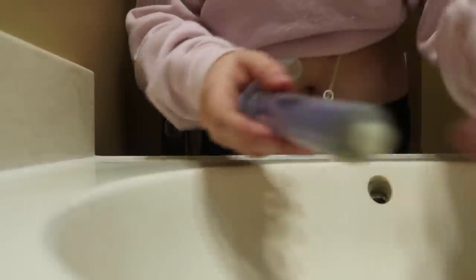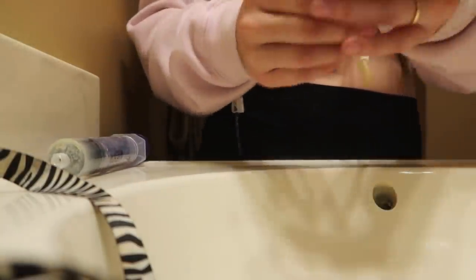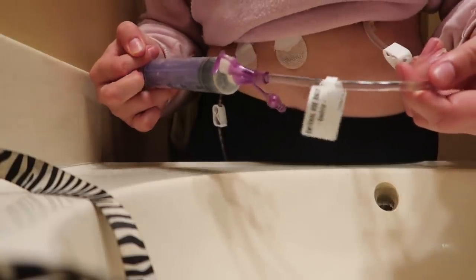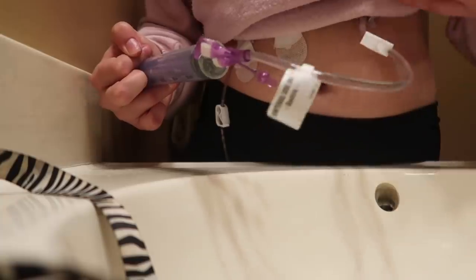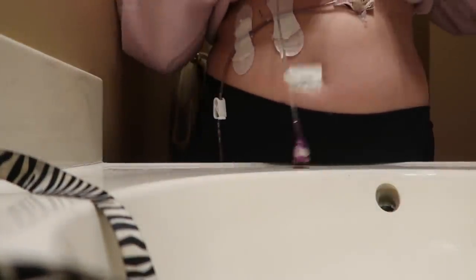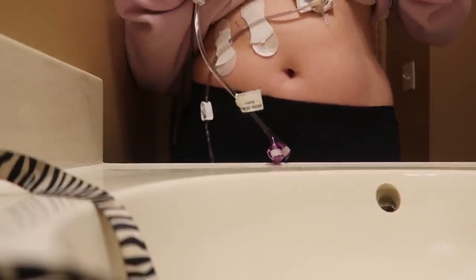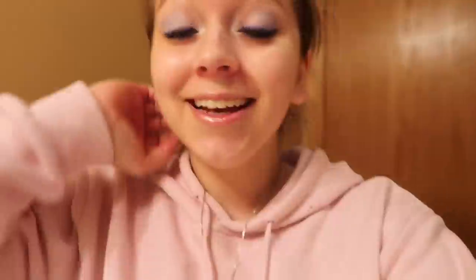Then what I'll do is take a syringe with just a little bit of water, hook up the syringe, unclamp it, and flush it through so the line is clear. Then I close the extension. If I'm just draining intermittently I like to take off the little extension because then there's less on my stomach. I put the extension next to my syringe and that's it — I'm done.